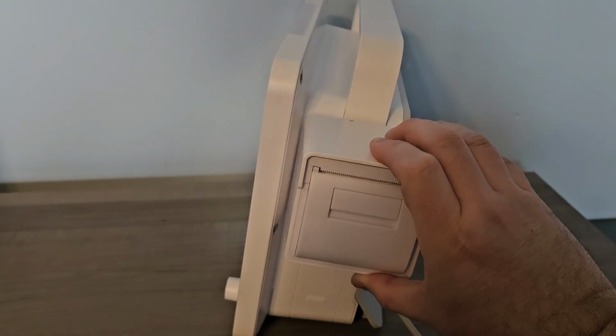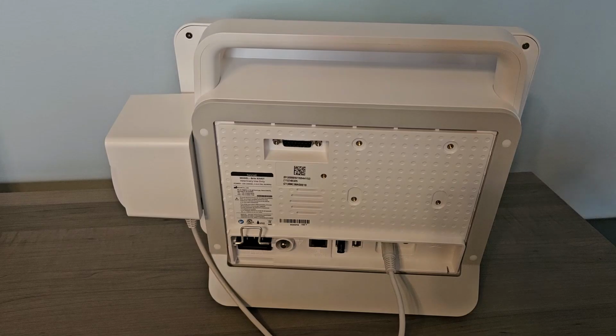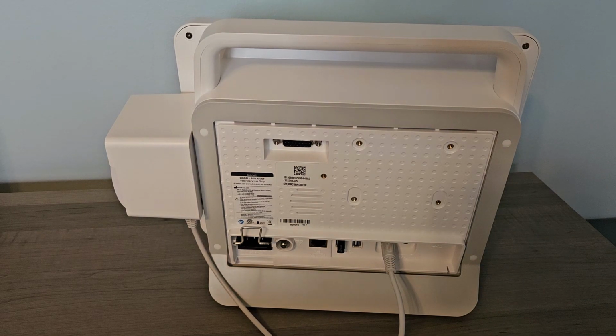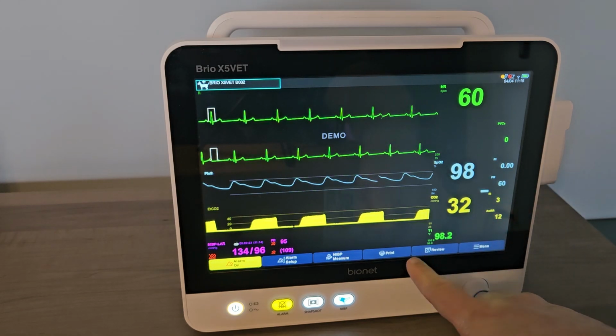The included printer is detachable and can be mounted on the side of the monitor. To allow printing, plug the printer into the circular port on the back of the monitor. Once the printer is plugged in, a print button on the touchscreen will appear.